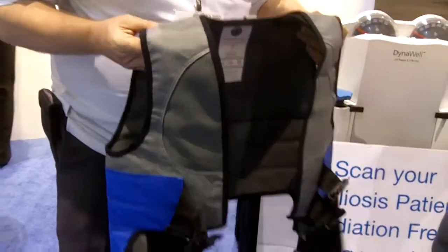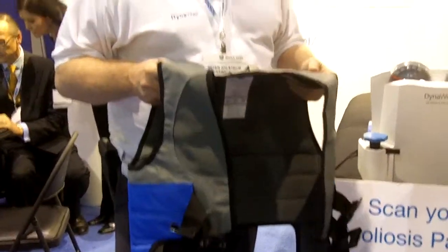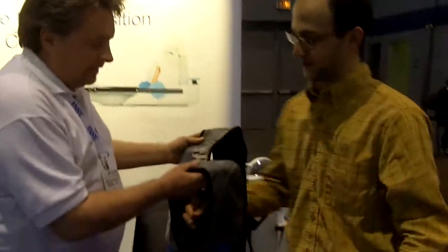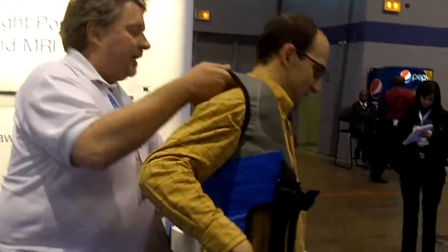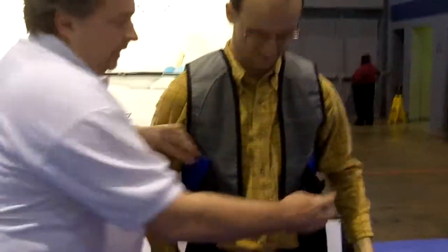How this works is it comes in four different size vests — medium, large, extra large, and even extra extra large. It works as a jacket, and what you do is you simply close the jacket.